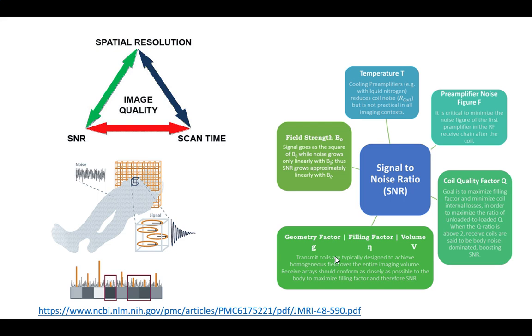So it's better for the resolution. There are questions about when you get really strong field strengths, what does it do to the human body? Right, because you're causing molecules to move. This is essentially what a microwave does, right?